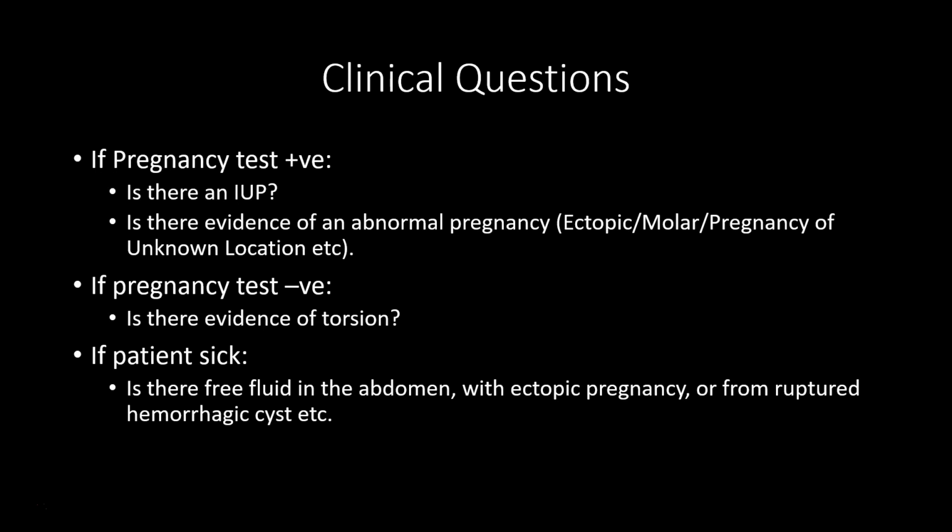The hope is that every single patient you see will have an intrauterine pregnancy. The bias that I walk into to see any patient is going to be to assume the opposite, right? Like in any research, you assume the null and prove otherwise. So I'm assuming that there is not an intrauterine pregnancy, and my job is to either prove that there is one, and in the setting of a patient with low likelihood of a heterotopic pregnancy, we can stop there. And if the patient is at high likelihood of heterotopic pregnancy, then they need much closer monitoring anyways.